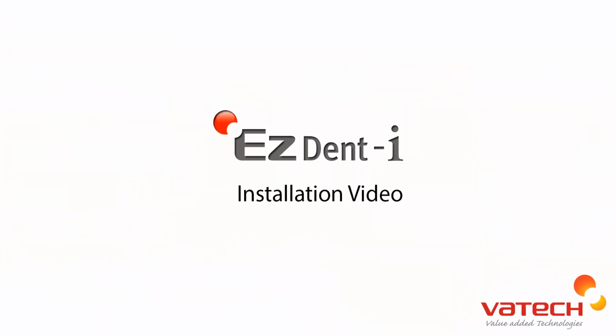This concludes the EzDent I installation video. For additional instructions, please refer to your user manual or contact our customer support team.